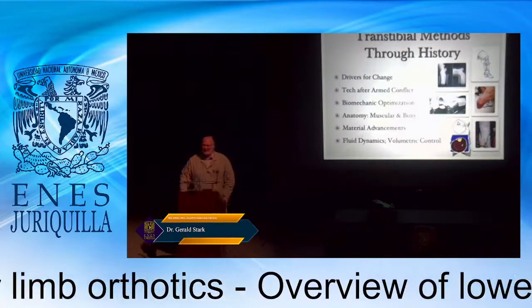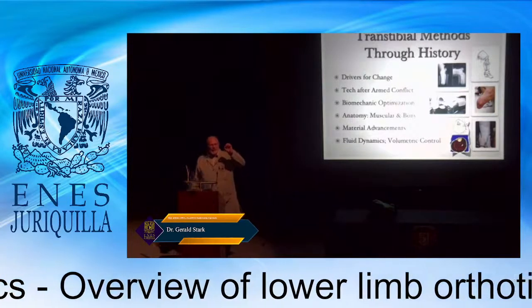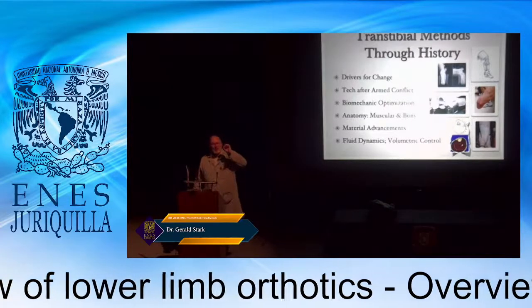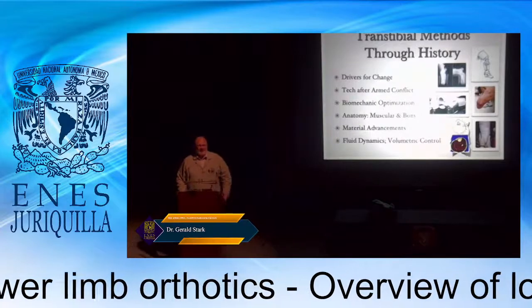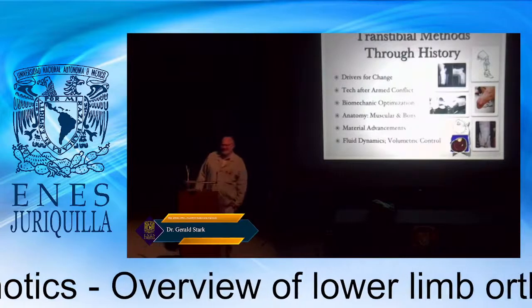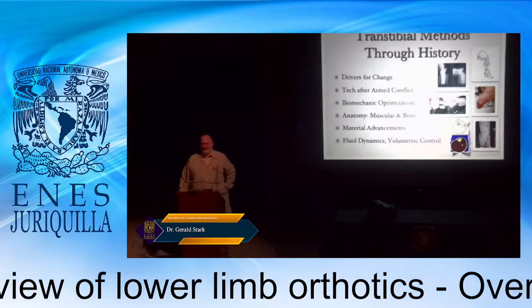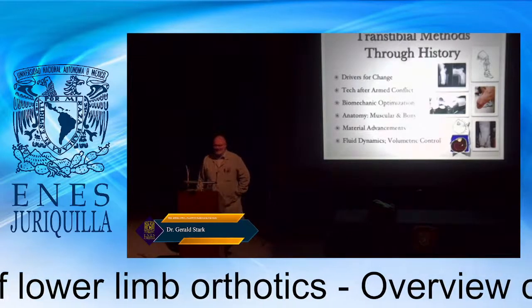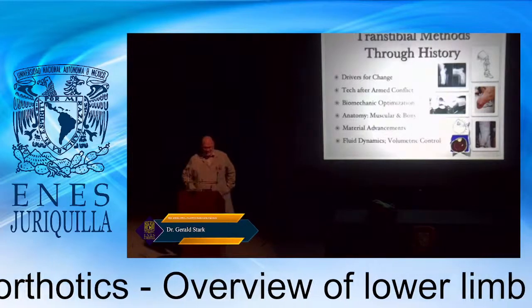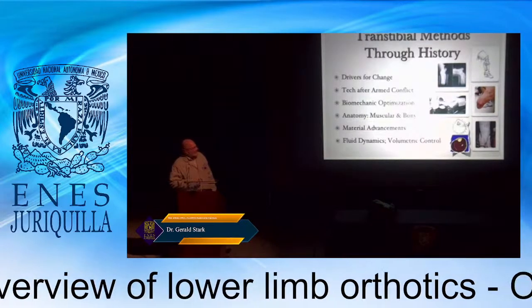Does anyone want to guess how many ply of fit? So a ply is thickness, right? One ply would be the thinnest sock you have. Maybe two nylons would be one ply. Usually their goal was to fit what? Can you guess how thick? It was about 10 ply of fit. So it would be like if you wore 3 socks on your shoes and said, that's a good fit. That's what they typically saw. So with wooden legs, yes, they took a lot of handcraft, but they weren't necessarily better.